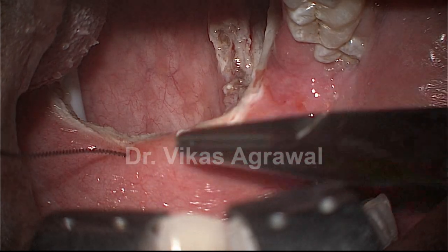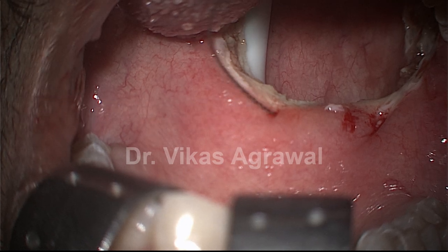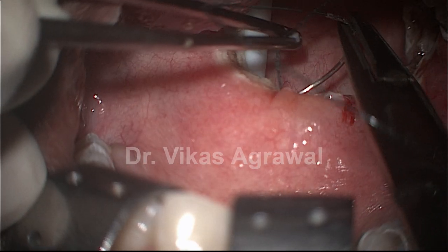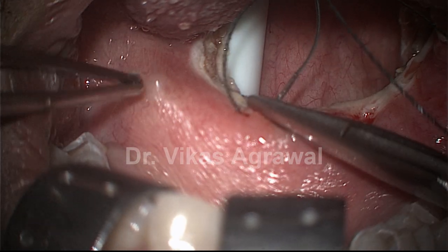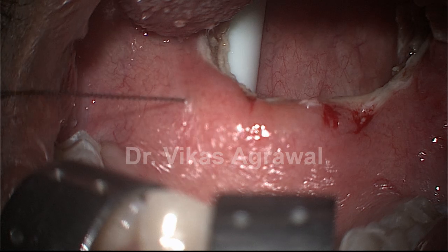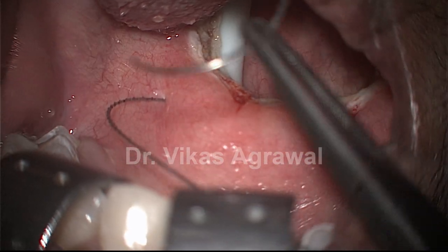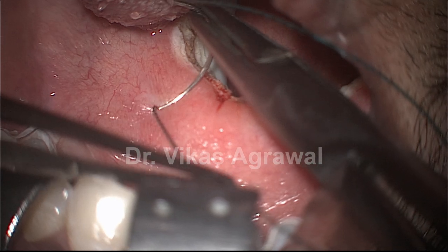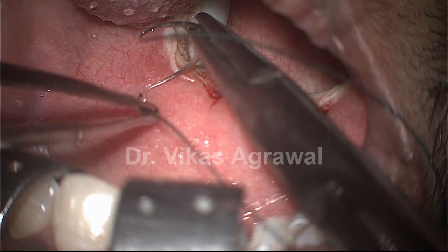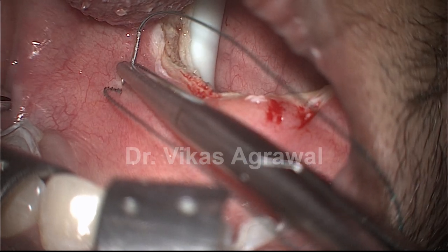What this will do: it will form a suspension bridge between the two sides. From here I will go to the other side. Again entry from the same point so that the suture is not exposed. Again entry from the same point, going through the same point, and come out beyond the pterygomandibular raphe.